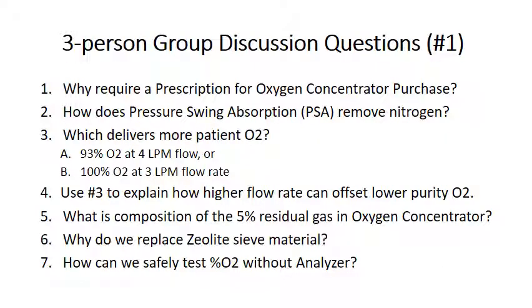Before we discuss the mechanism of pressure swing absorption and how oxygen concentrators are used for supplemental oxygen and for oxygen delivered through a ventilator, we'd like you to get together in small groups of 2 or 3 and see just how much you can teach each other. You are professionals.